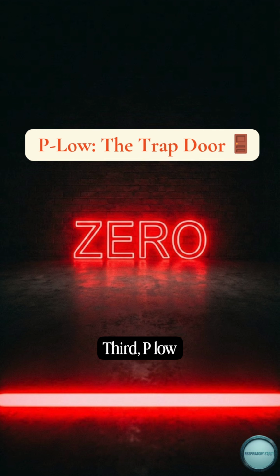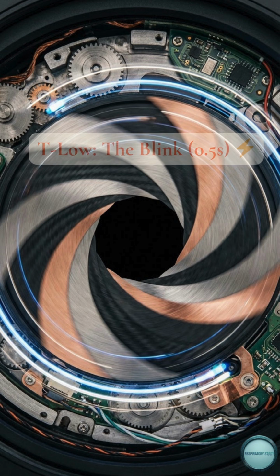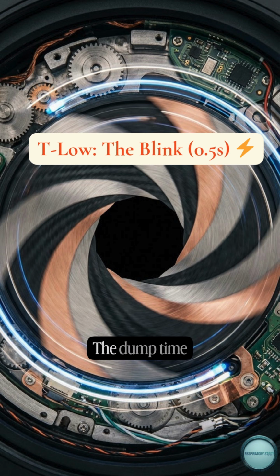Third, P low. This is your release pressure. We almost always set this to 0. Yes, 0. Don't panic. I'll explain why in a minute. Fourth, T low. The dump time. This is tiny, 0.5 to 0.8 seconds. This controls ventilation, or your CO2 removal.